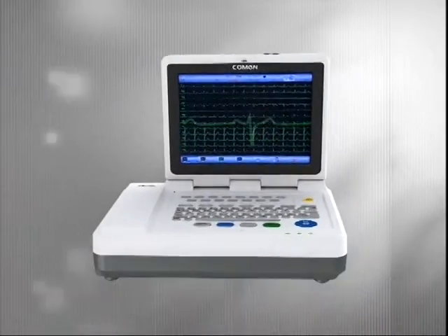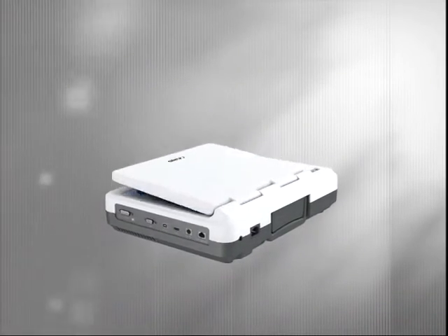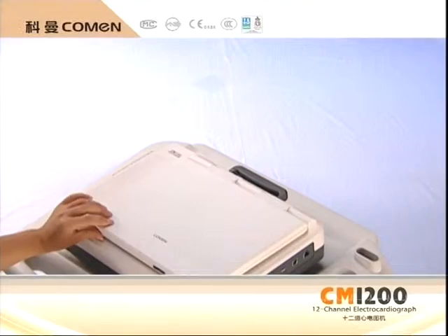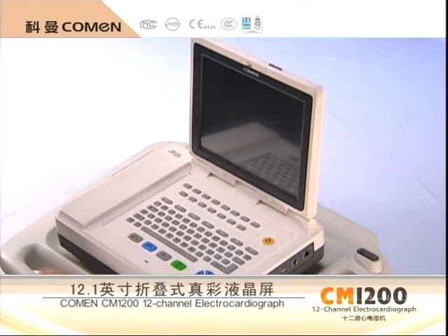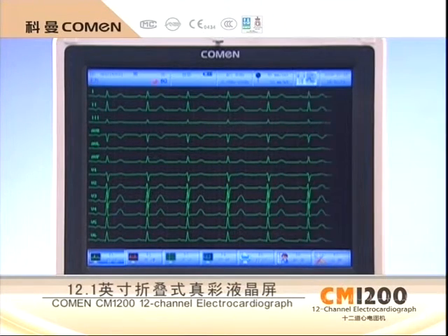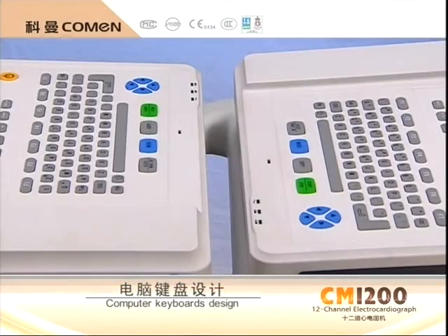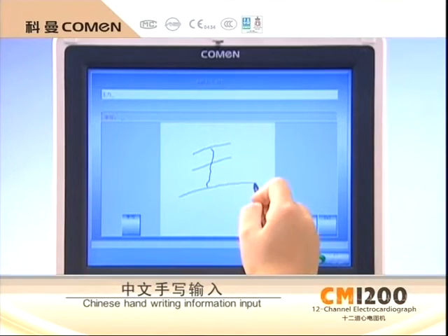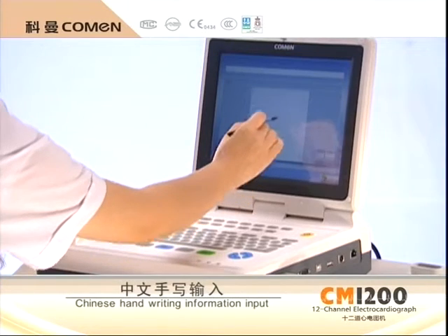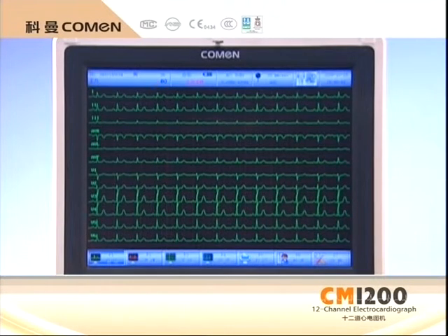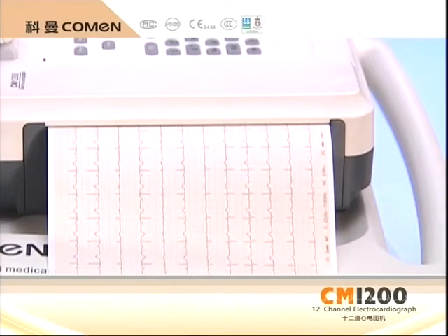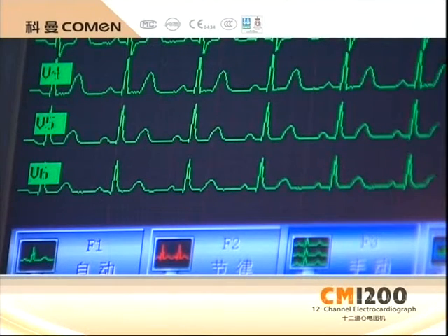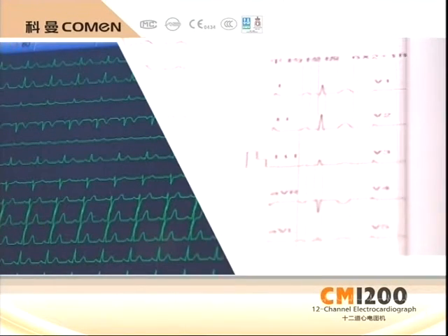In virtue of the unique innovative multifunction design and outstanding performance, the CM1200 12-lead ECG with a 12.1-inch portable TFT LCD enables multi-angle viewing. Professional touchscreen operation and handwriting input contribute to easier operation and control. The ratio between display wave and printing wave is one-to-one, and the screen grid matches the recording paper grid, so screen diagnosis can be easily achieved, benefiting more effective real-time treatment.